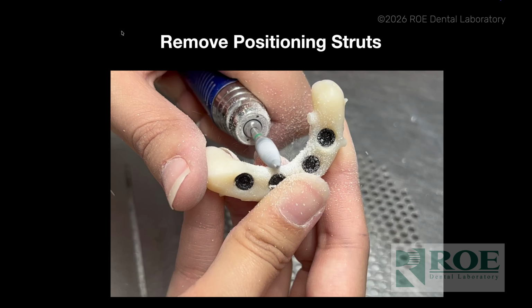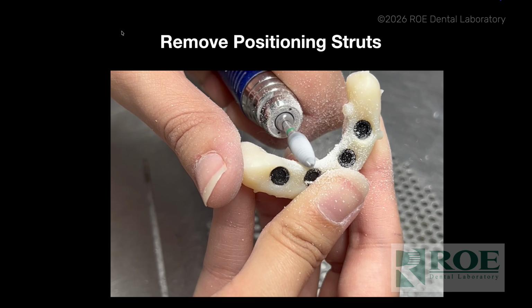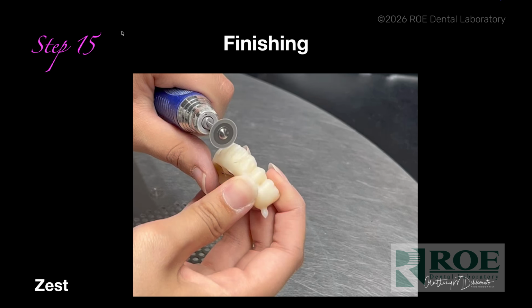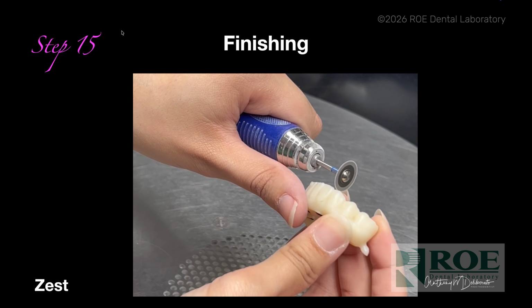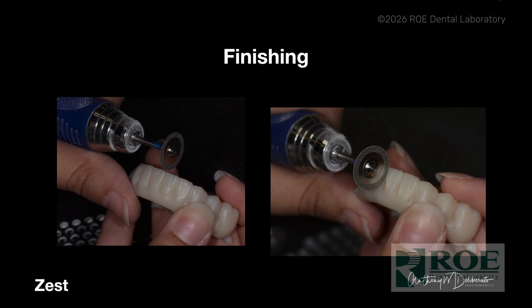So now we've cut off the struts, and now we're just going to smooth off any little bumps or edges, make the prosthetic very smooth and cleansable. And then we're going to use some discs to enhance the incisal embrasures and make the prosthetic as aesthetic as possible, so it looks like individual teeth.